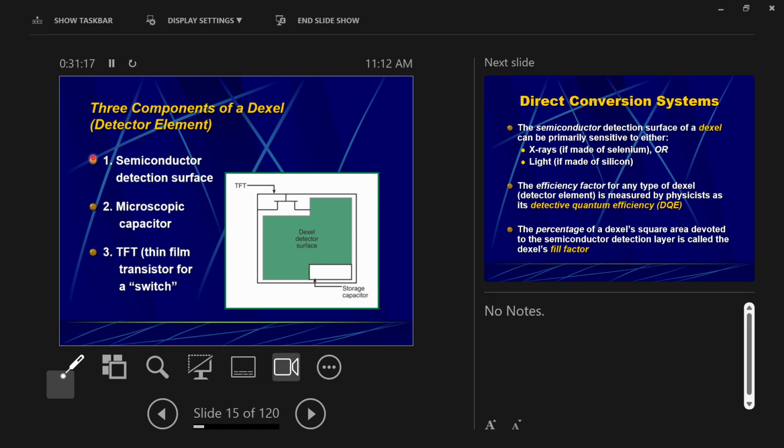We think of things like some semiconductors conduct electricity only at very specific voltages, okay? Others conduct electricity only when you shine a very special kind of light on them. There's a bunch of different types of semiconductors. You know one of them for sure, and that's silicon, right? Because you've probably heard of Silicon Valley, right? The place down south where they have all the computer advancements being made, Silicon Valley, right? Good. So silicon's a semiconductor, okay? Selenium is a semiconductor, okay? So we're going to learn about semiconductors here in a little bit.